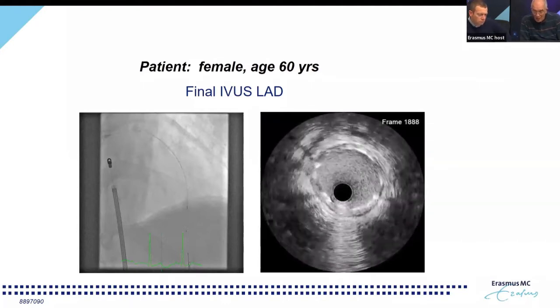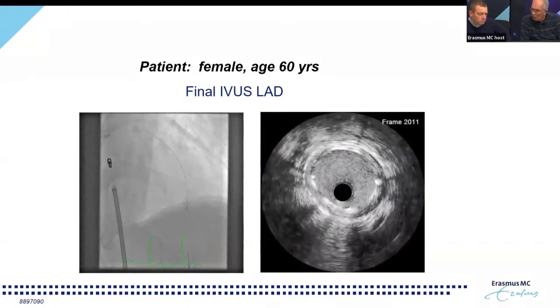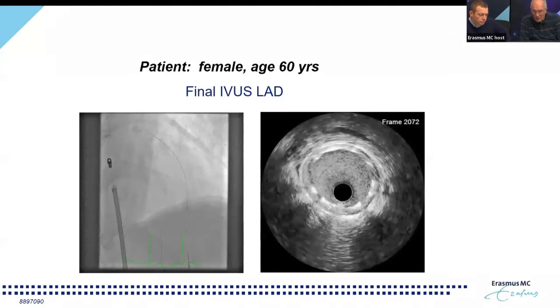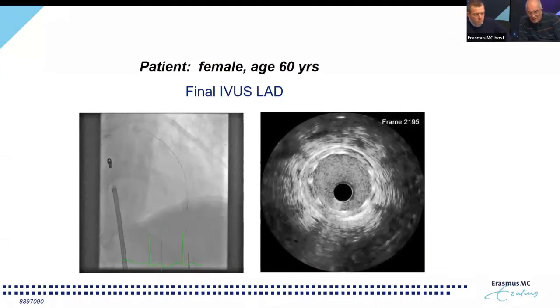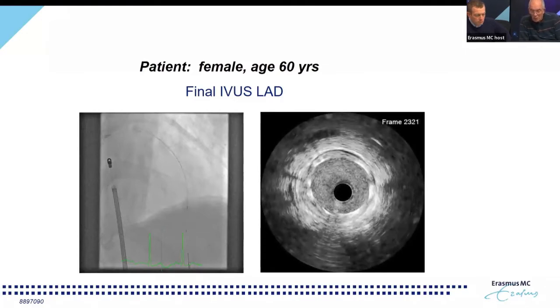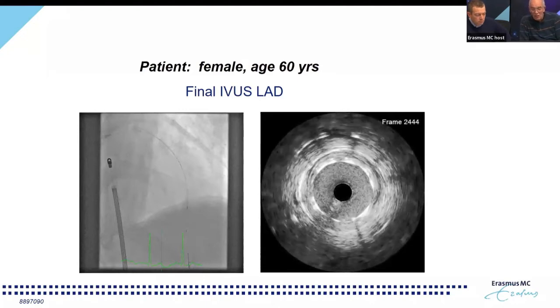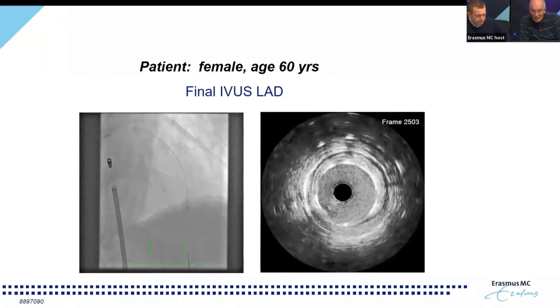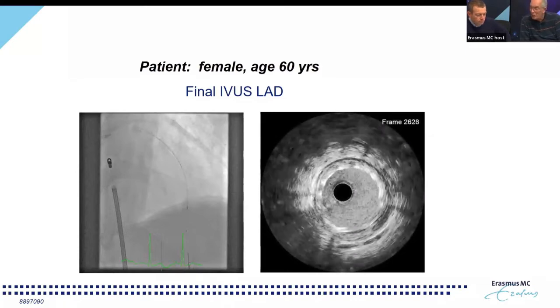Don't step into the trap of thinking, well, we have to post dilate to the wall. Remember, the size of your hematoma is not the correct size. Here you can see it behind the stent. There is this black line, so that means your stent is apposed. Although you may think that at 7 o'clock you see malposition, that is in this case not true. That's why it's so important that you know what you're dealing with beforehand.